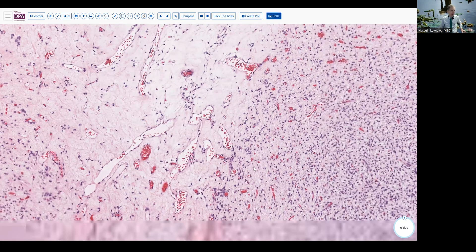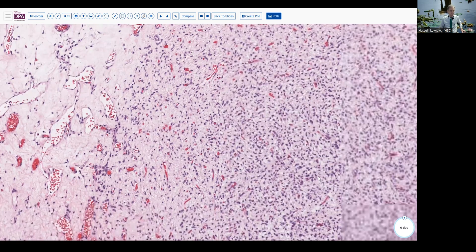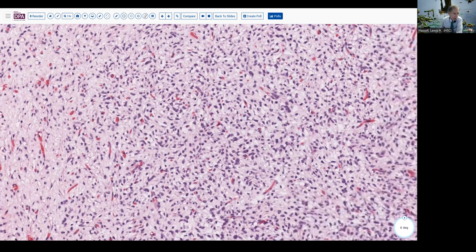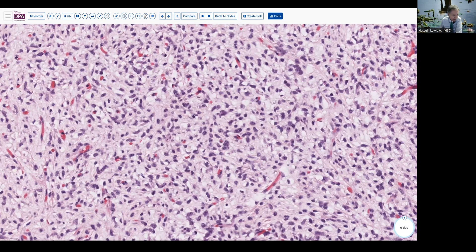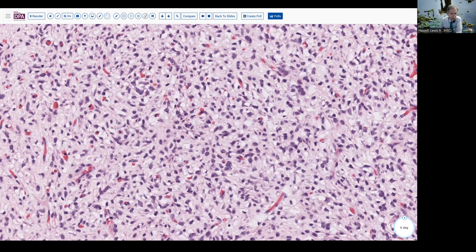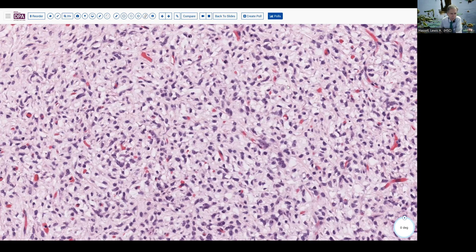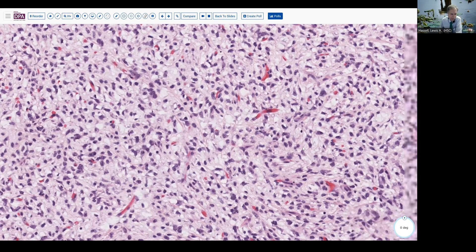So we're thinking more in the neoplastic lesions of myxoid liposarcoma or possibly myxoid chondrosarcoma. Here we can see a little bit more about these cells, and we see there are a few areas where we start to get a little bit of vacuolar formation, maybe a suggestion of some signet ring type forms. They're not really epithelioid signet ring cells, but they certainly have this indentation and a clear vacuole. That's pretty good suggestion for a lipoblast in this situation.